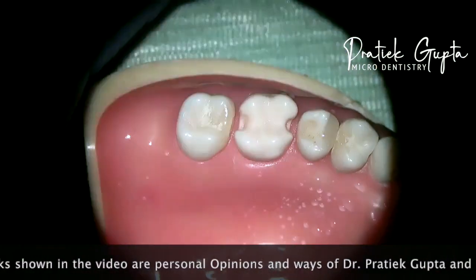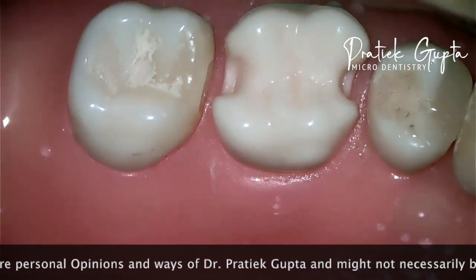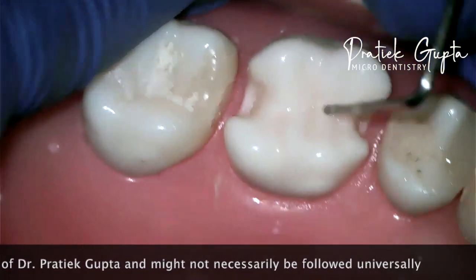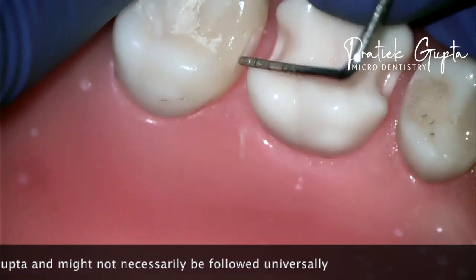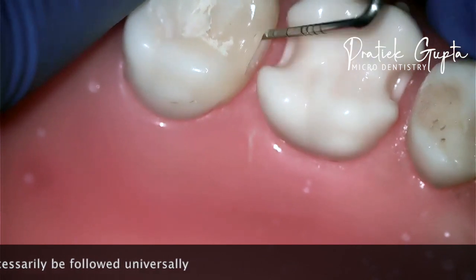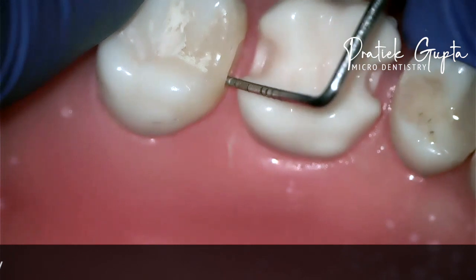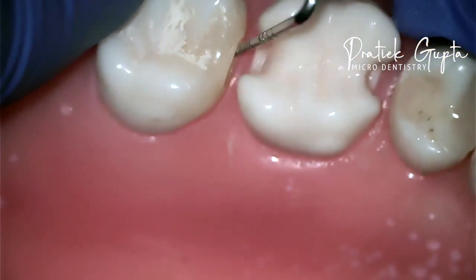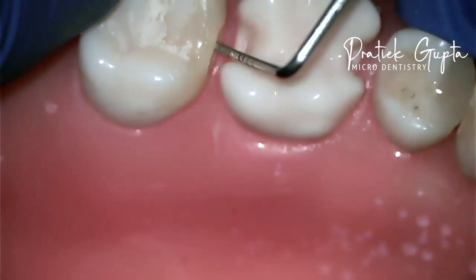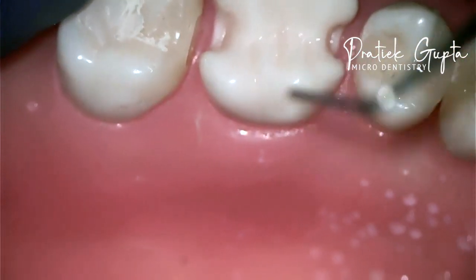Everyone commonly asks me how do you decide on which matrix to use where. Another common question is how do you restore an opportunistic access — there were some caries there, which is very commonly seen when you have two adjacent teeth. So I thought I will make a little video for you to understand how both of these things happen.